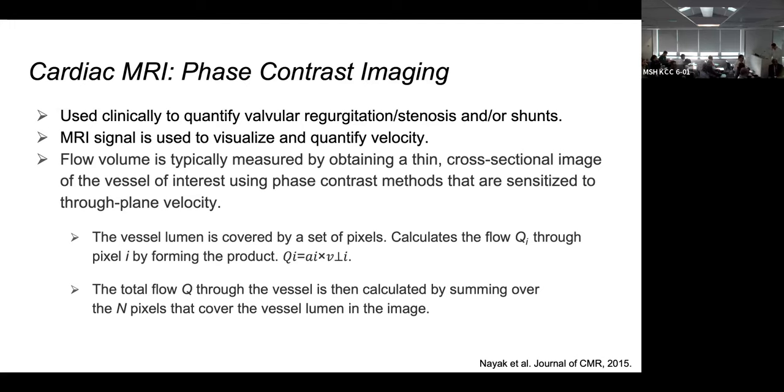So all of these measurements that we do are really reliant on prescribing at the correct velocity and prescribing the correct plane. Yes. This is in contradistinction to echo, where our views are more limited. We're making an assumption that it's circular, which it is not. We also have no way to do the velocity encoding that we're talking about here. Right. We are making the assumption. We know what it is at the highest, and it's sort of some distribution someplace, whether there's a lot of hand waving. It's done where it goes from wide to more narrow. We're assuming it's laminar, and we're assuming all the velocities are the same across this magic non-existent circle. Those assumptions aren't being made here. This is direct measurement, just to point out accuracy and so forth.